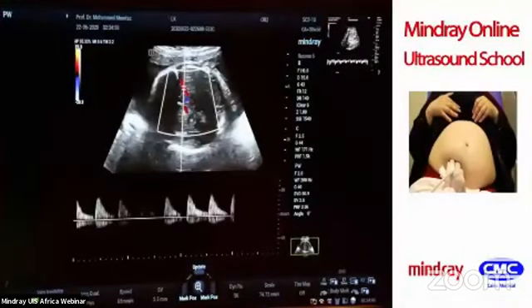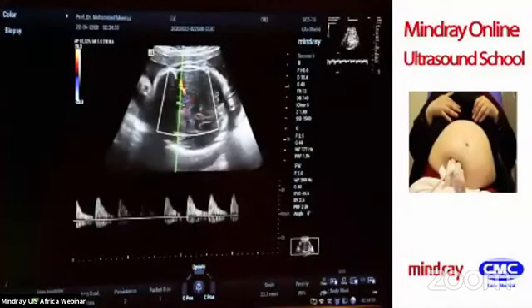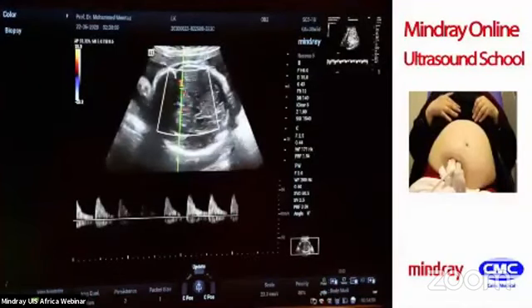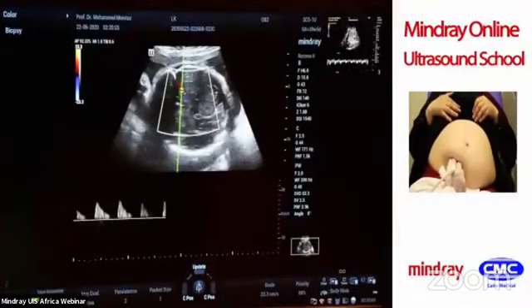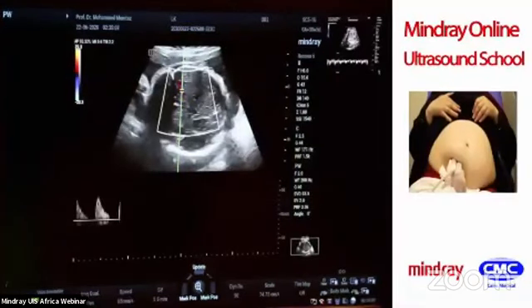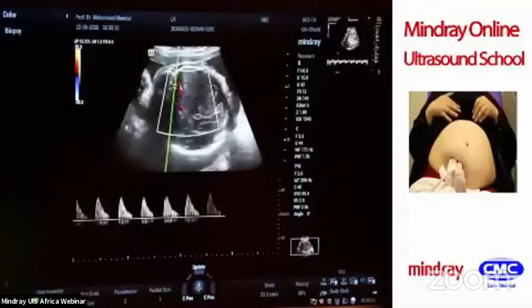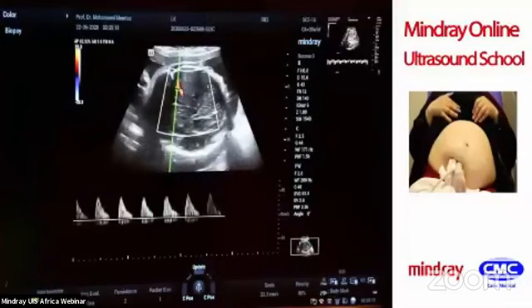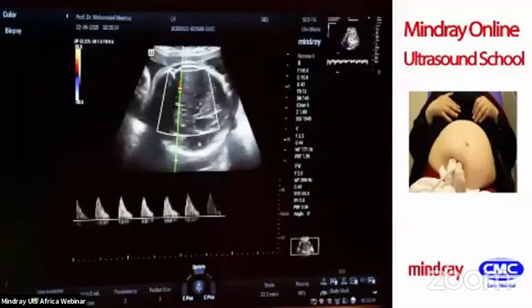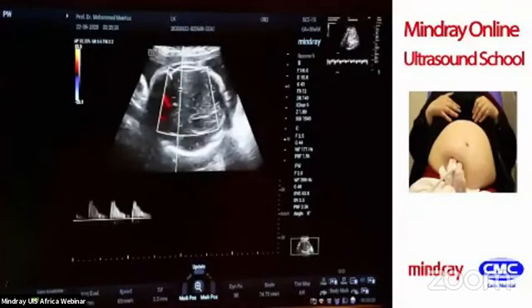Usually, of course, the diastolic flow is low, and hence the indices are high. This is normal in the middle cerebral artery in cases with normal placental function. If you have a normal umbilical flow, you don't need to detect the middle cerebral or see the ratio between the two. If you have high resistance in the umbilical artery, then you should look, of course, for the ratio between the umbilical artery Doppler and the middle cerebral artery Doppler. Okay, this is the middle cerebral.